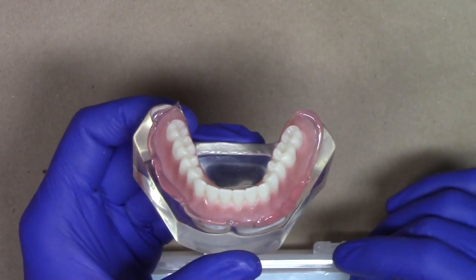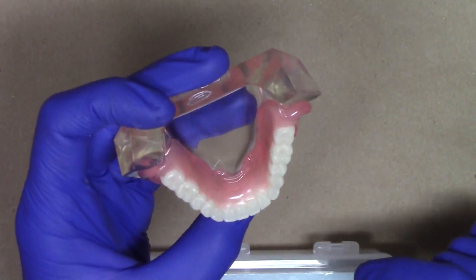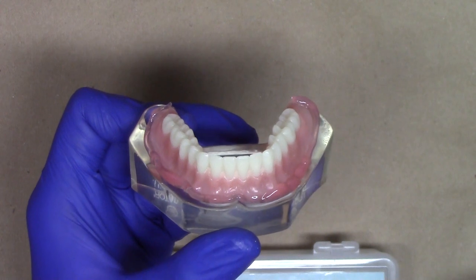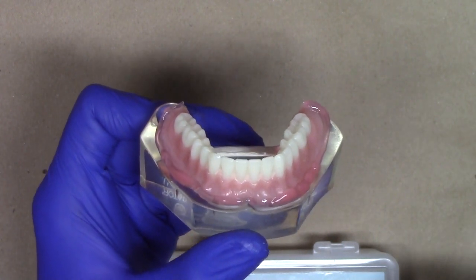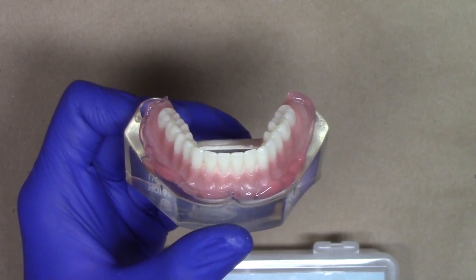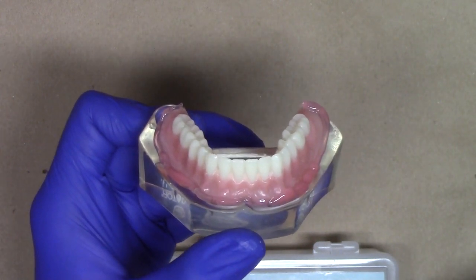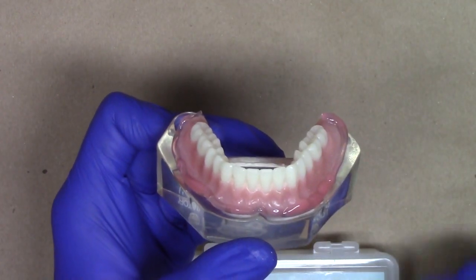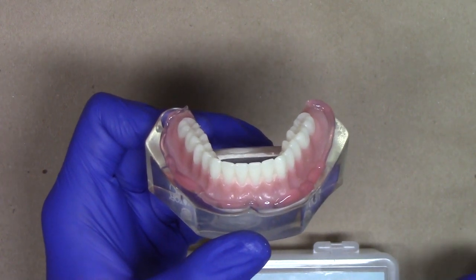And then additionally, I would have them lick their upper lip to ensure that the proper lingual border molding was occurring. And the cheek side was already done. Ensuring that I've had the patient close into their proper position is going to ensure that you have not increased the vertical, and you're going to have minimal chances of having to do any sort of bite adjustments afterwards. This will differ quite a bit from our traditional chairside attachment processing material pickup technique. The soft liner, you want the patient to close down into centric. It just will greatly simplify your procedure.